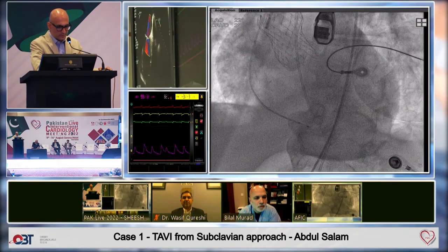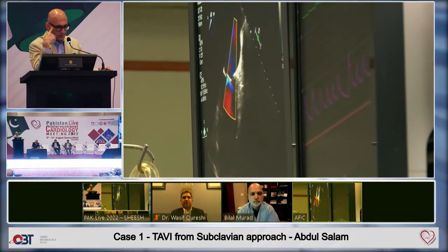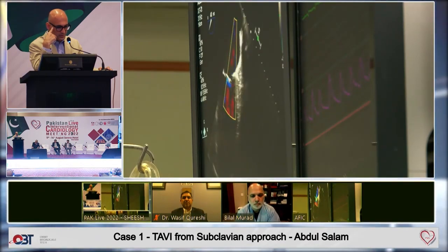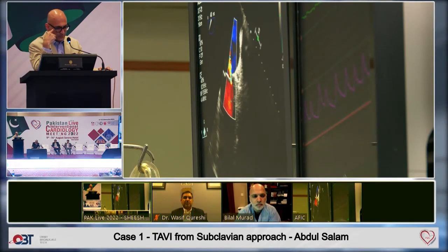Yeah, I think the degree of AS that the patient had, they're going to feel much better now that the AS has been relieved. And so a great result. Do you have any final comments before we switch over to our next mitral case?